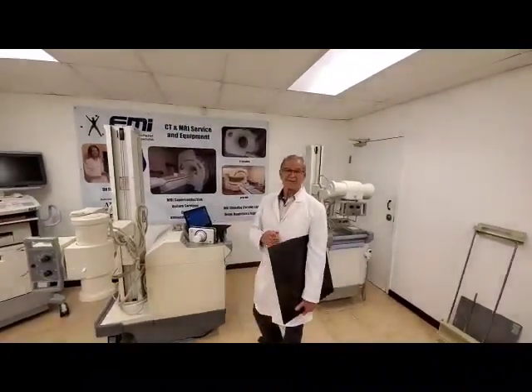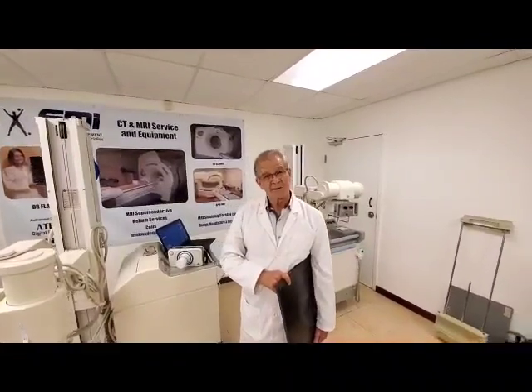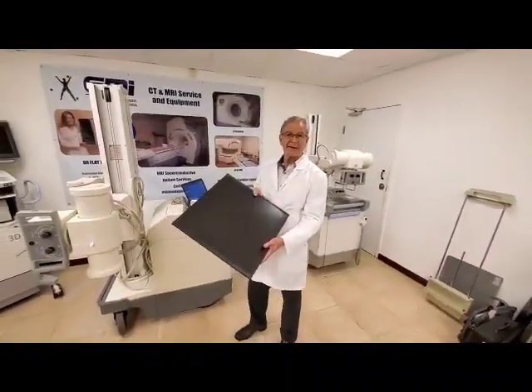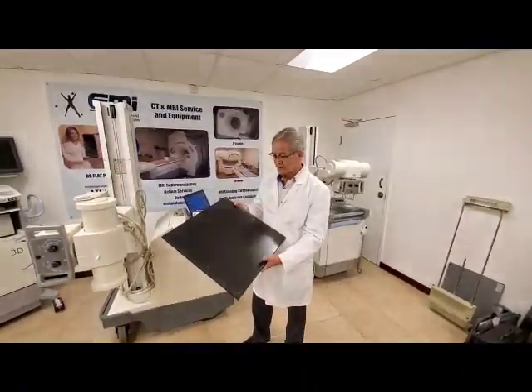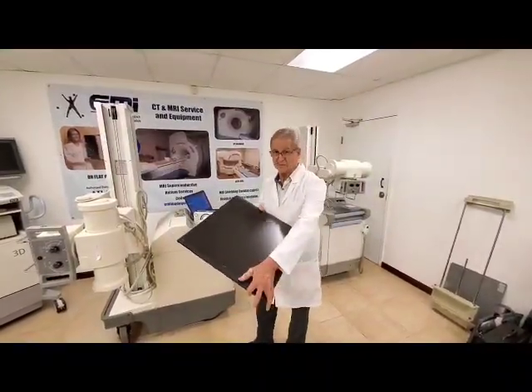Hello, this is Rodolfo Gutierrez, President of EMI America Miami. I'm going to present to you this new flat panel x-ray detector. This is a very light, very modern system which produces very high resolution images.